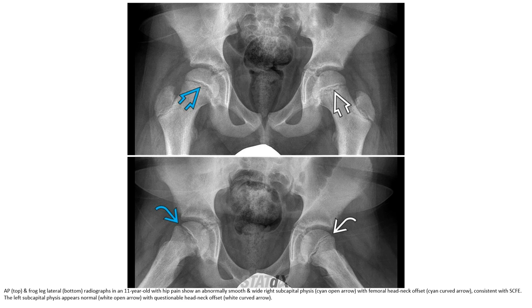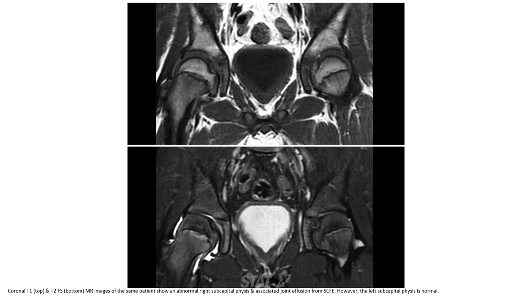AP (top) and frog-leg lateral (bottom) radiographs plus T1 (top) and T2 fat-saturated (bottom) MRI images of an 11-year-old with hip pain show: on the right, an abnormal, smooth, and wide subcapital physis with femoral head-neck offset, consistent with slip capital femoral epiphysis. The left subcapital physis appears normal with questionable head-neck offset. MRI of the same patient shows abnormal right subcapital physis with associated joint effusion from the slip. The left subcapital physis appears not involved.